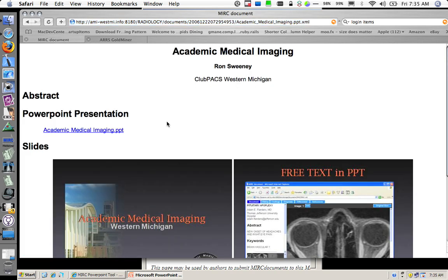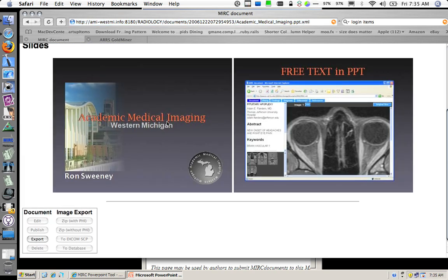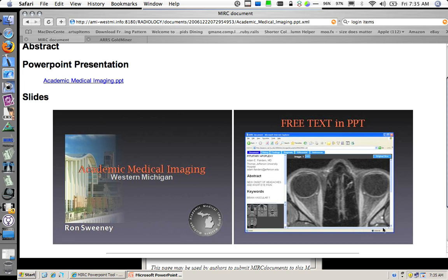And there it showed me back to the actual PowerPoint presentation. And if I wanted to download this, I could download this on my computer. This is in JPEG format here.